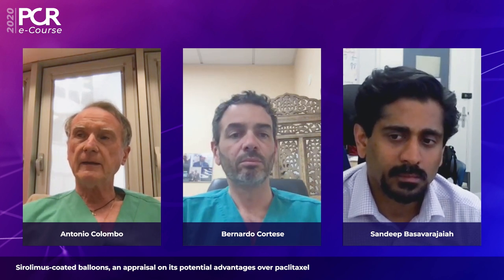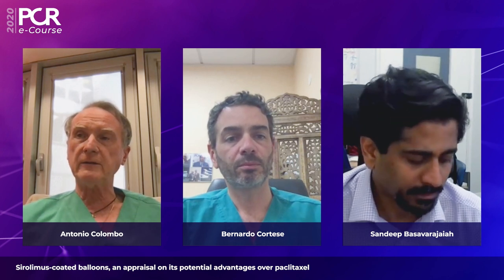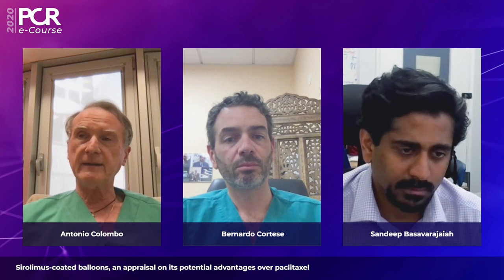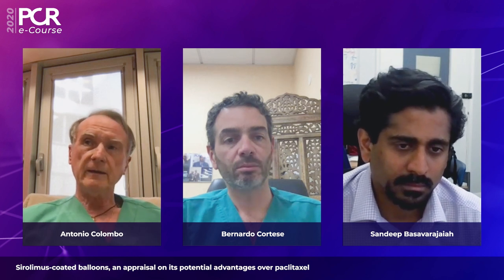But accepting an immediate crossover of 20 to 30%, you can avoid long stent in a number of lesions with all the benefit we know, including the positive remodeling that you showed pretty convincingly.